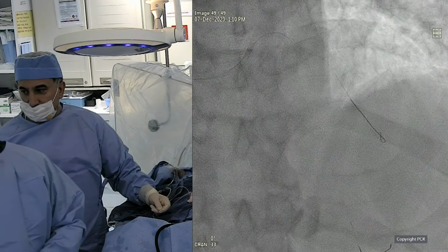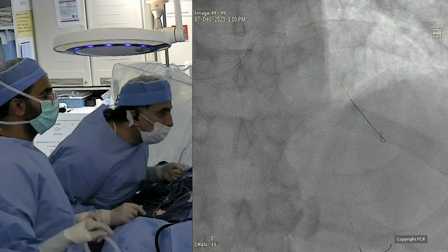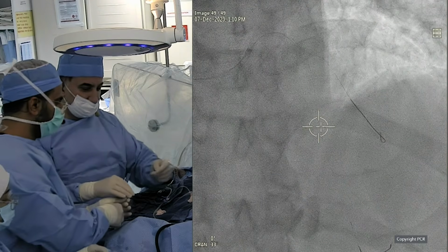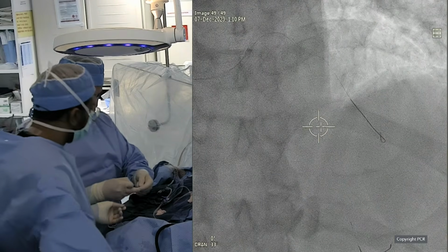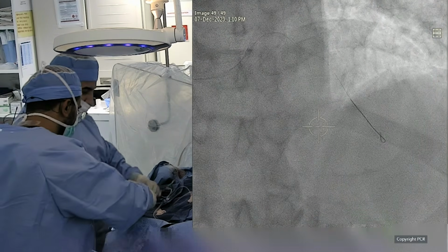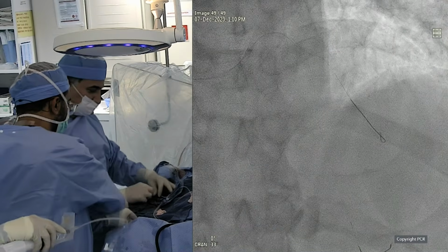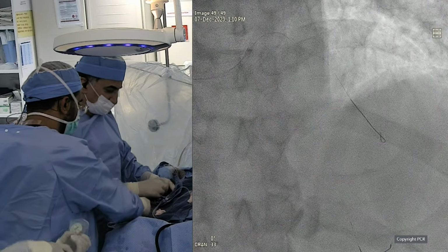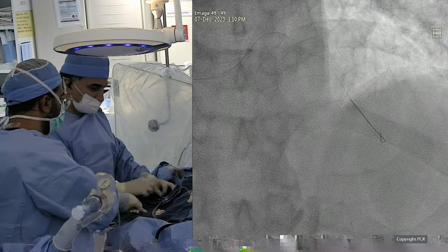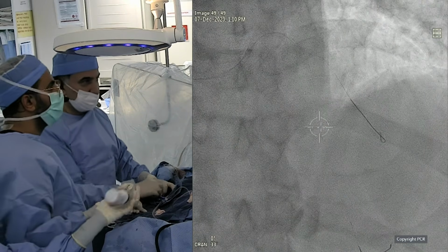Okay, that is a crucial point. People are talking about nodular. Many times you have all these types of calcium combined. So it's not just one entity, but you can have a protruding, very smooth calcification, then at another point you might have an eruption, then you have a plate of calcium. So the concept is this is a severe calcification and might have all these different types.